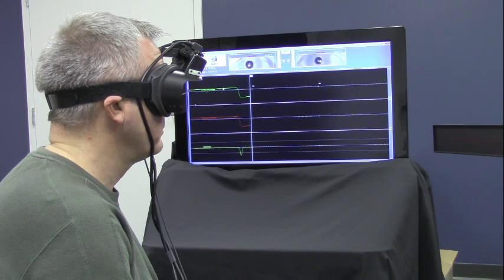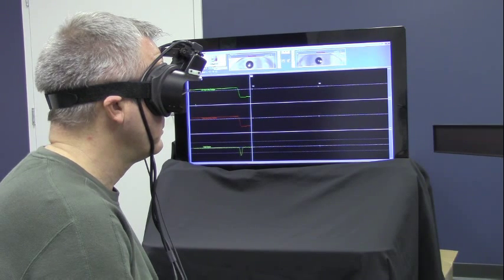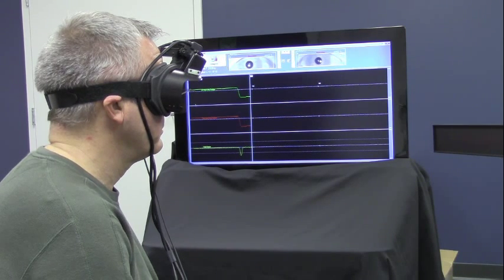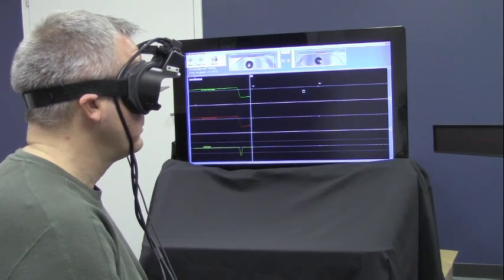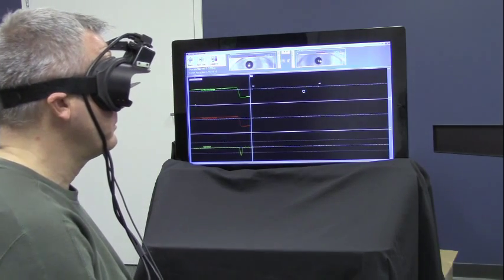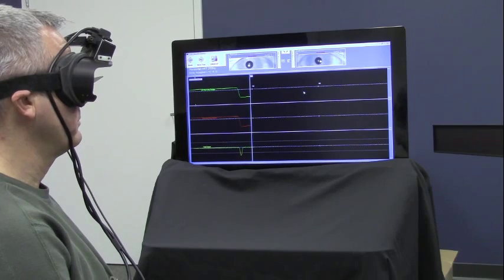If you want to see the analysis, click on analyze. It will give you the analysis of the VHIT test.